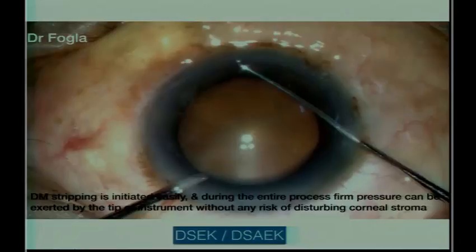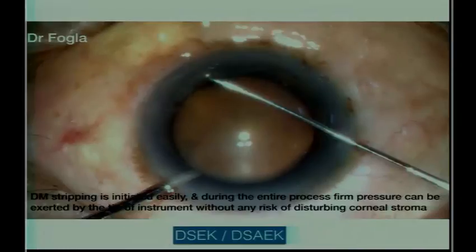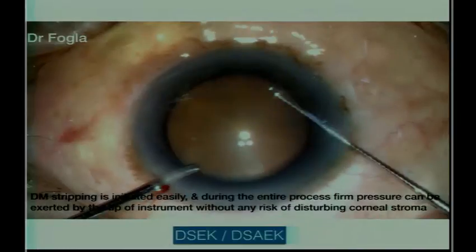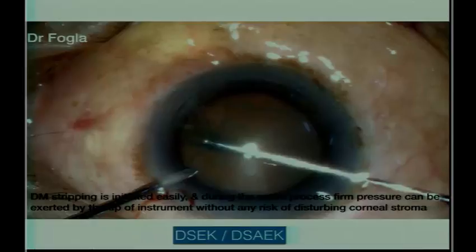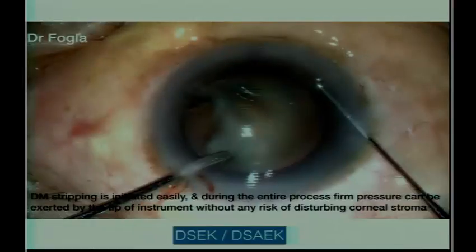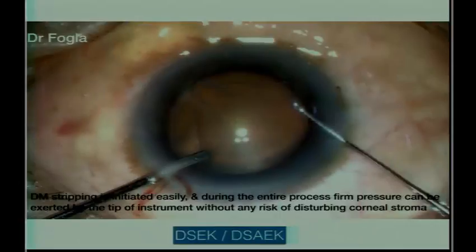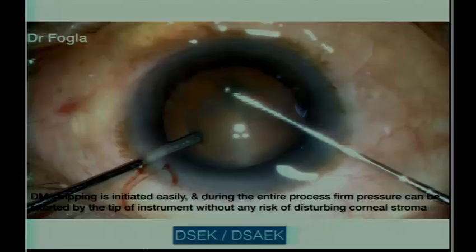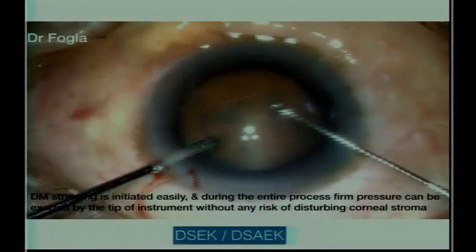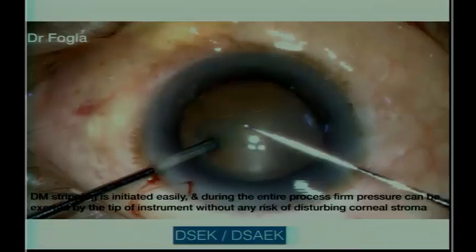The only disadvantage of this instrument is that if your Descemet's is fibrous or if it is thick, then sometimes the ball tip Descemet's hook is not able to break the Descemet's in one go. You may need to make multiple attempts to try and break. But once you break it, you can easily strip without having the fear of breaking the stromal fiber. So this is very good for people who are starting on endothelial keratoplasty, and sometimes people tend to break the stromal fibers and they are pulling on the stromal fibers thinking that that's the Descemet's.